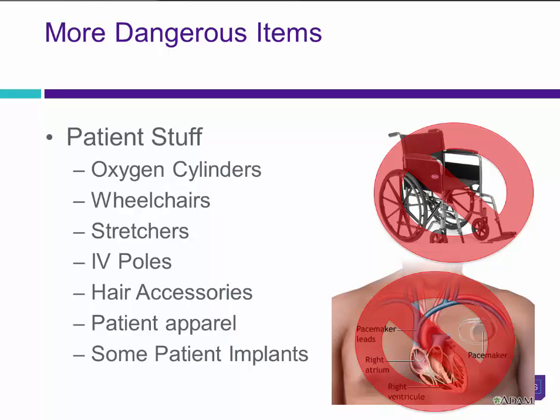As well, we have to be concerned about the patient's dress and accessories. Some facilities will require patients to change into scrubs or gowns to ensure the apparel is known before entering the suite. Finally, questions are always asked during the interview process with potential MRI patients to review any possible hardware or stents the patient has implanted to ensure there aren't any compatibility issues with the study. In the event of questions, your local MRI technologist is the on-site expert and should be able to answer or get an answer regarding the appropriateness of any devices or the ability of something to come into the suite area.